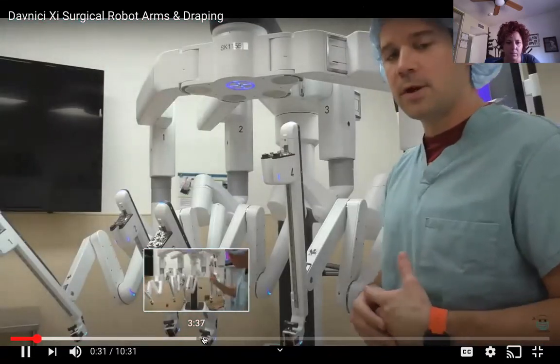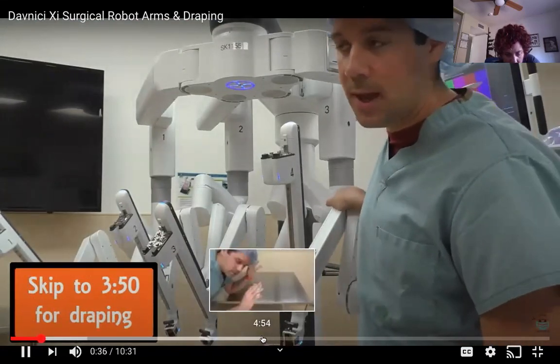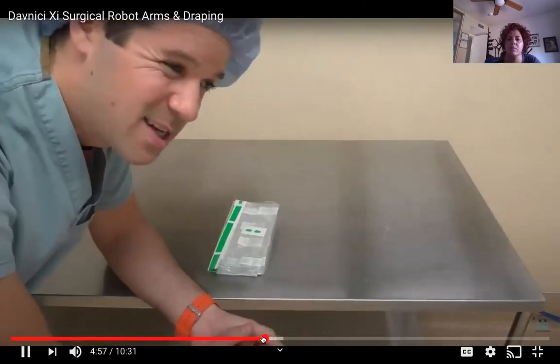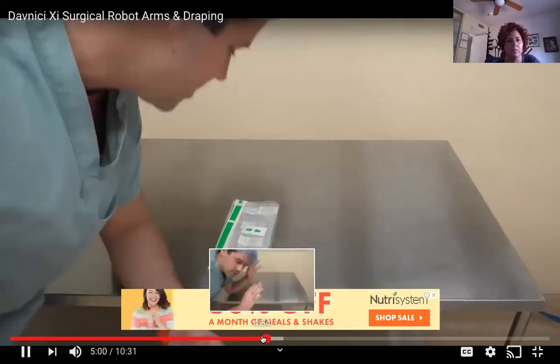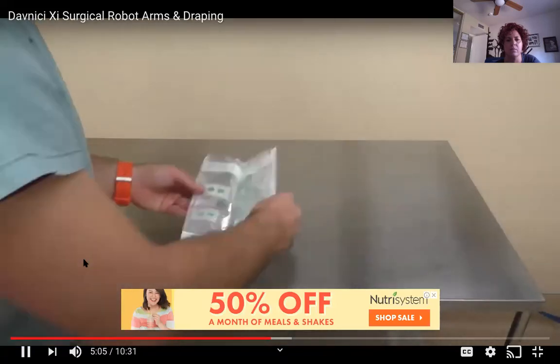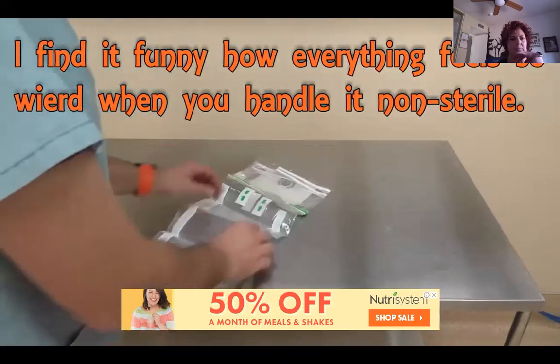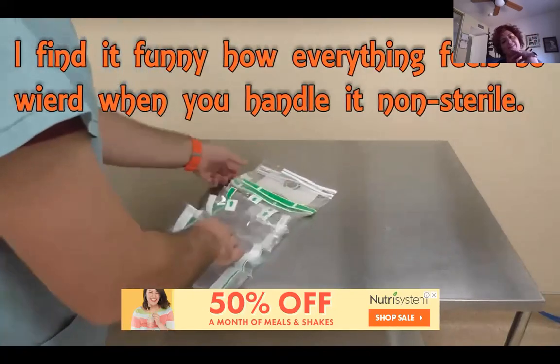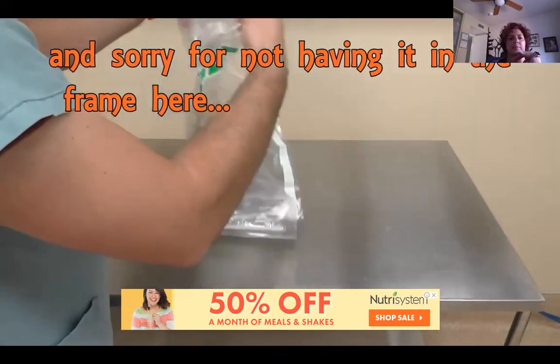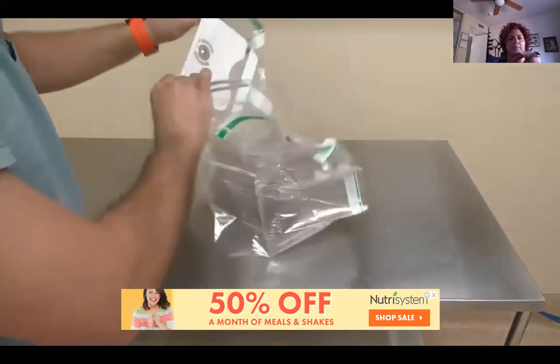All right, so first off, we're going to be talking about how to move these arms specifically, and also I'm just doing it with my bare hands, so you're going to kind of have to use your imagination a little bit. This is our column drape when you get it on your table. We're just going to open it up. Just like that.